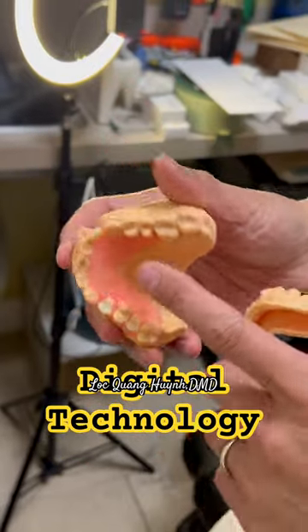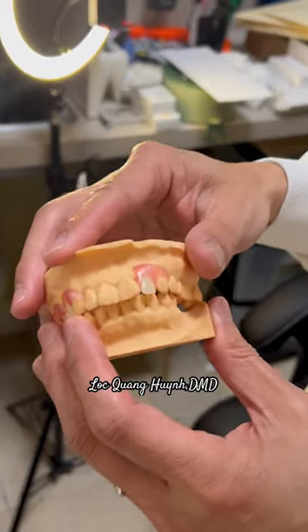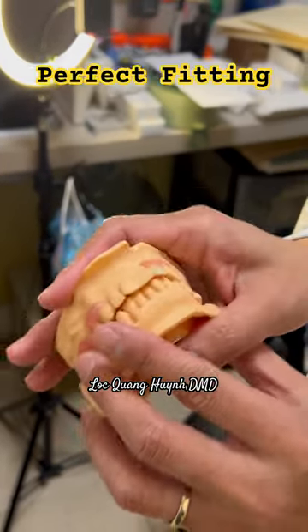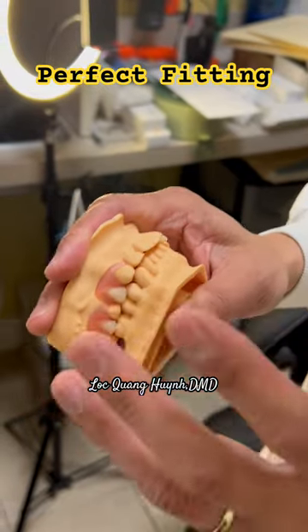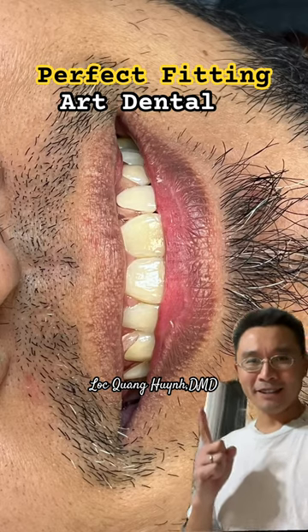I just want to show you that this is the 3D printer — they printed it out. We did a 3D scan and that's what it's going to come out as. I just want you to understand the advantages of doing a 3D scan. He's a smart patient; I hope that he likes it.